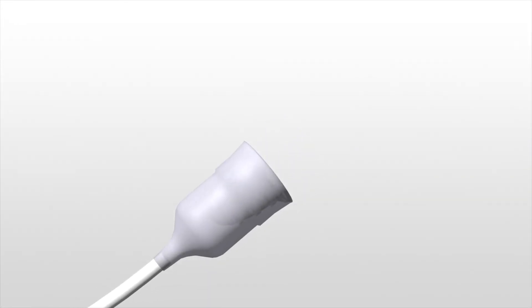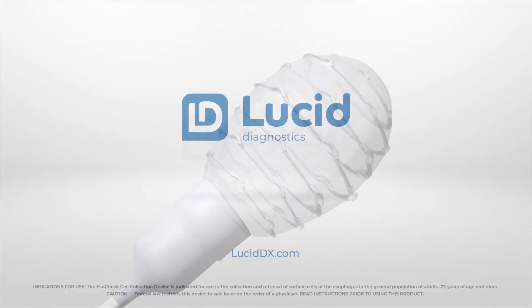ESOCheck, a novel, non-invasive, five-minute office-based procedure to safely and simply sample cells from the esophagus.